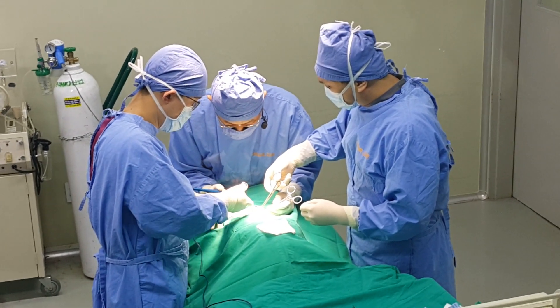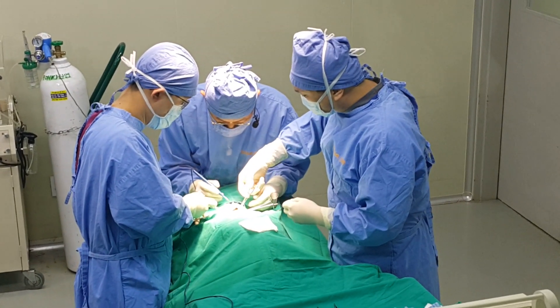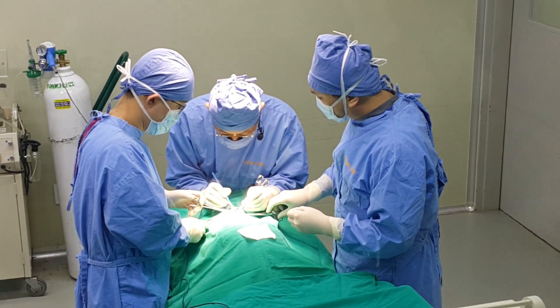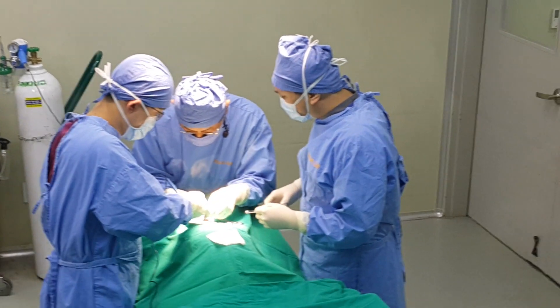What he has in his hands is the electrical scalpel. He's using it to cut open a small opening to the abdominal area, from which we will transfer the embryos.